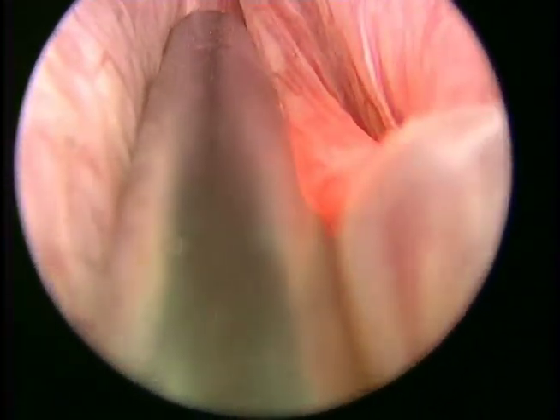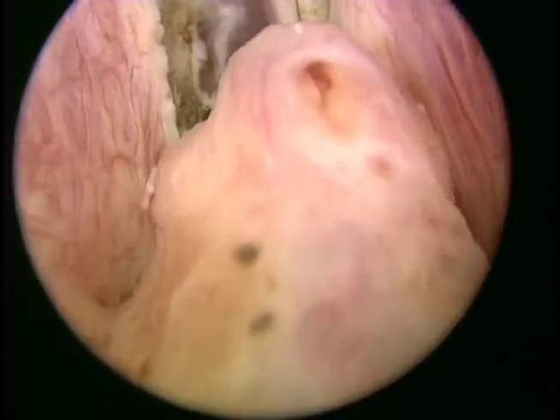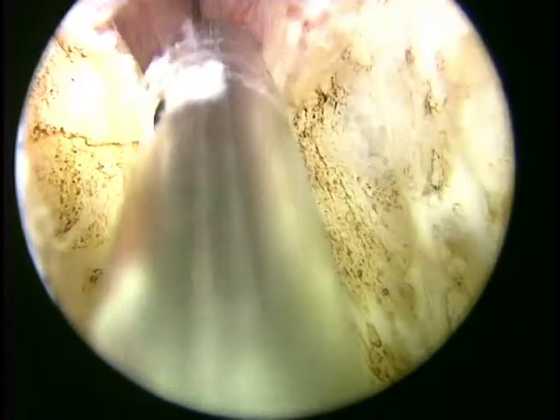We initialize surgery by first creating a distal margin by using the vaporization in a semicircular technique just in front of the verum montanum. This helps protect the sphincter and demarcate the edge of our resection to minimize the risk of urinary incontinence. One may encounter submucosal bleeding from the site, and simple compression followed by coagulation is all that is required to achieve good visual control.